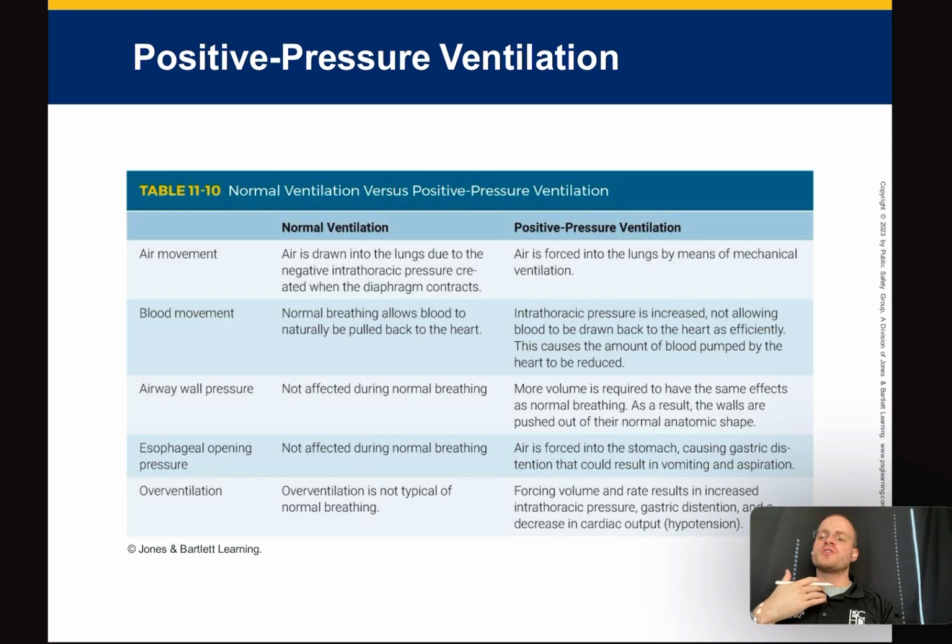They'll ask what's the consequence of using positive pressure ventilation. And you're going to be like, what, Hunter? I thought you said this was called a BVM. I thought you said this was a ventilator. I thought you said this was a bag mask. Yes, it's all of those, but it causes positive pressure ventilation. I am, with a positive pressure, ventilating the patient. And so that's what they're talking about here with positive pressure ventilation.